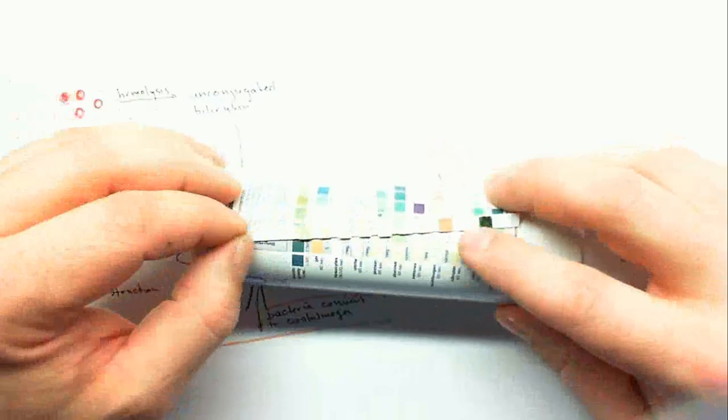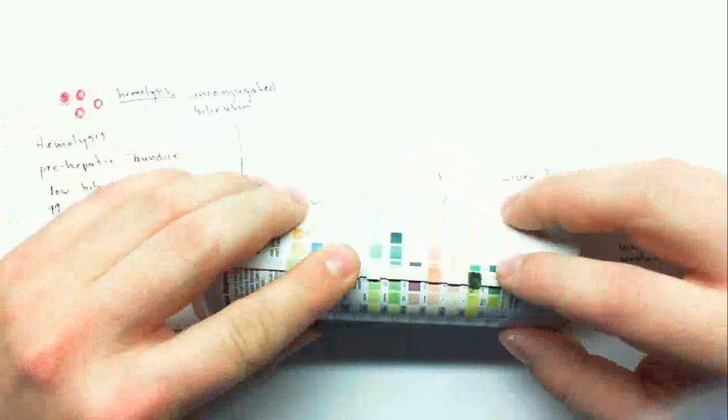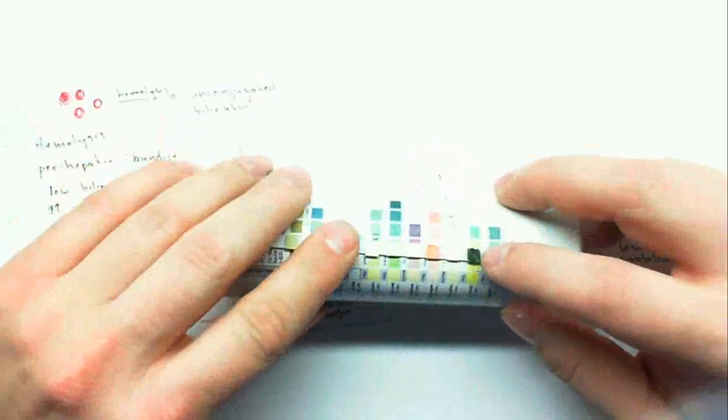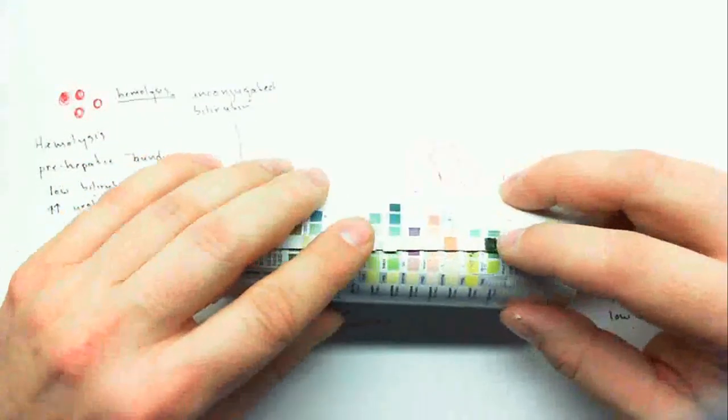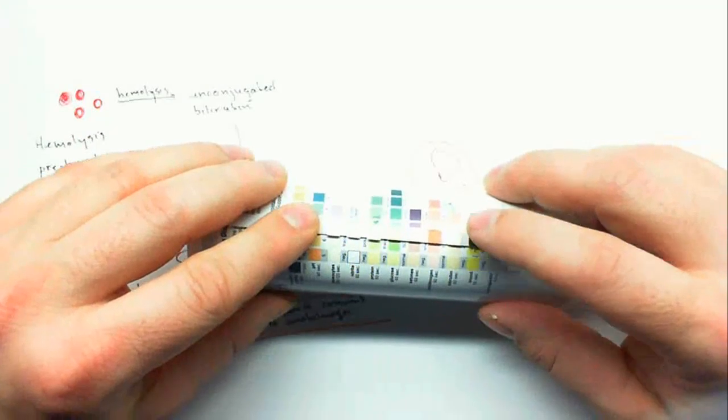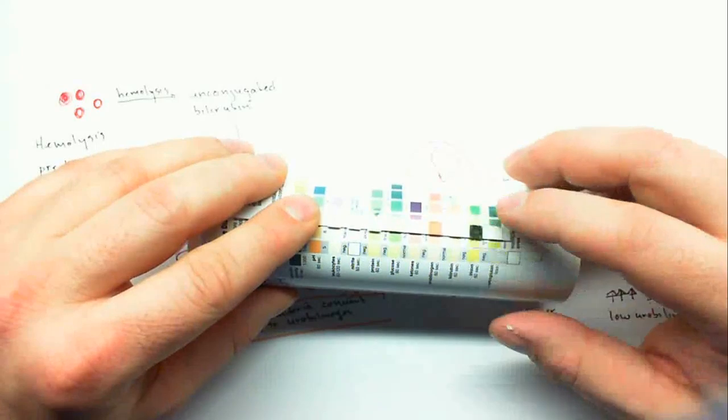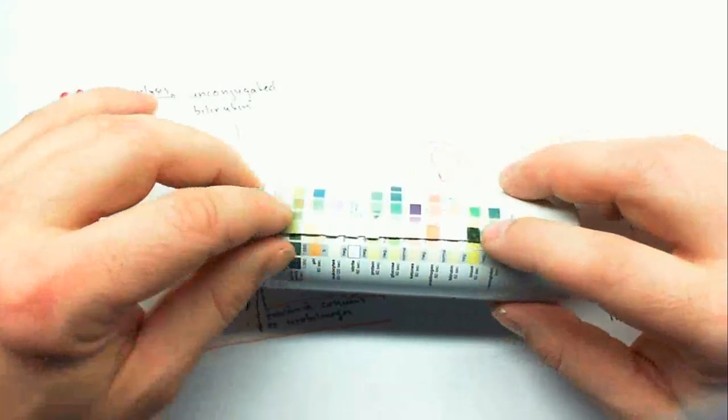In this stick, there's high urobilinogen and there's also hemoglobin. So high urobilinogen, there's also hemoglobin. There's not a punctate or spotted pattern, it's more of a uniform color. If there was also higher bilirubin, this could indicate liver disease, but since there's not an elevation in bilirubin, this suggests hemolysis, especially since there's hemoglobin in the urine.